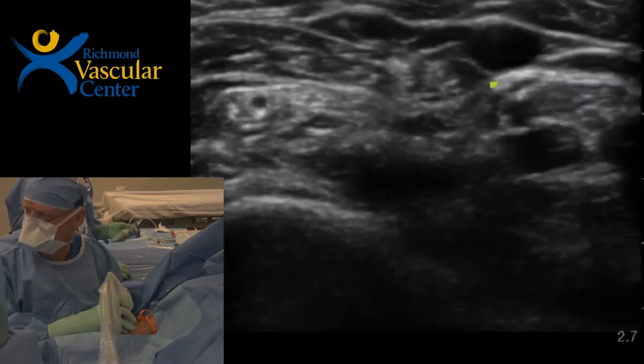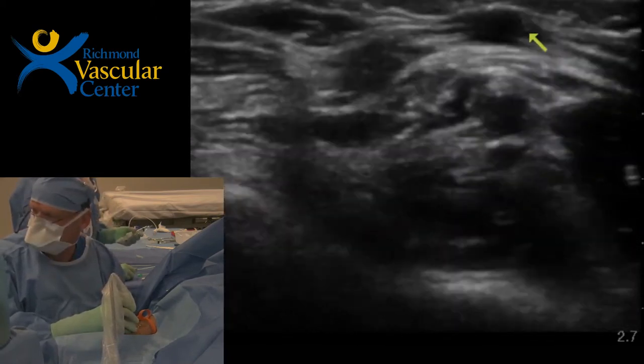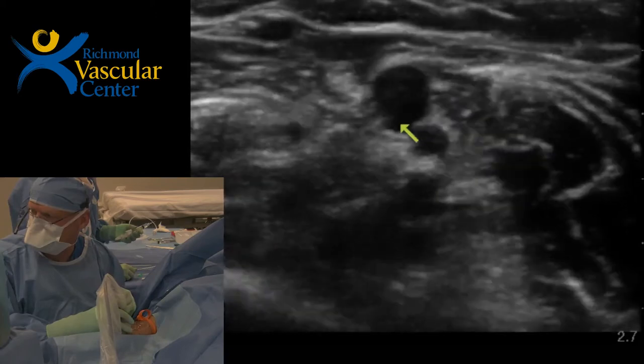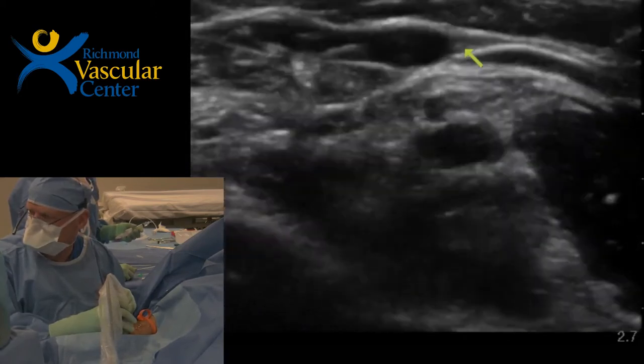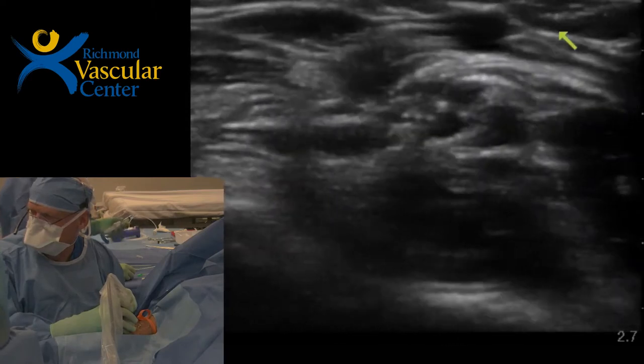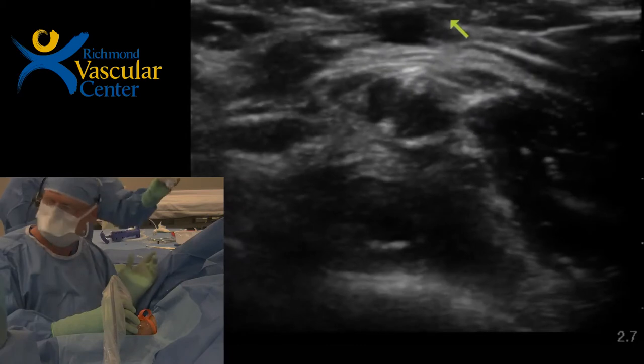You want to be able to make a straight line from your entrance to your crossing, and realizing that you're only going to be able to move the needle so much. So I'm going to start right there. Well, let me have lidocaine.